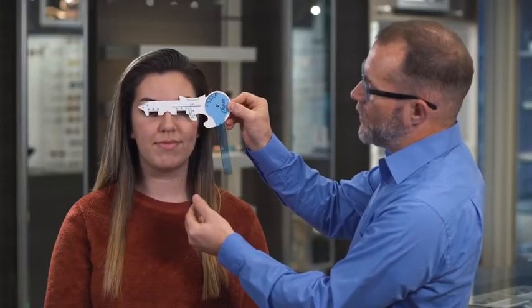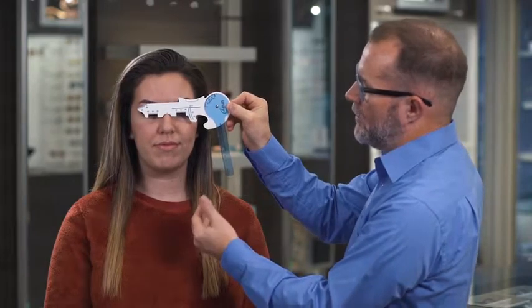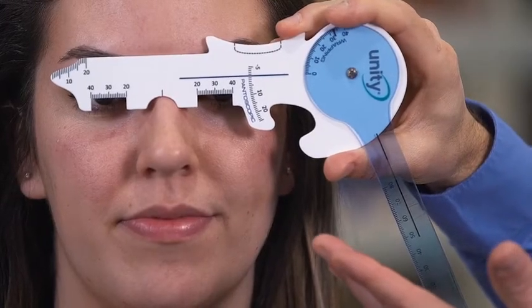Take the tool, rest it right in the bridge of the nose, just like so, and you'll be able to take your pupillary distance right there.